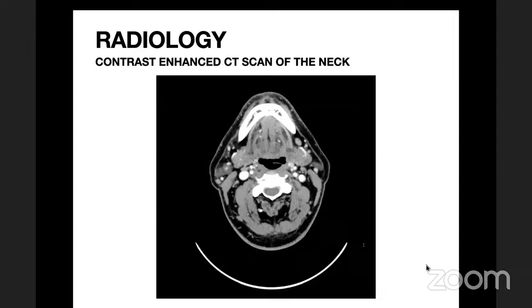Okay, you can go back to KK's question on measuring. If you had to take out part of the hypopharynx, then how do you measure and how do you decide on a slab? KK, you can take over. Yeah, I think she answered it. What I was telling is, if at all you want to check the deficiency, you have to check it at the narrowest level, which is at the mid level usually.